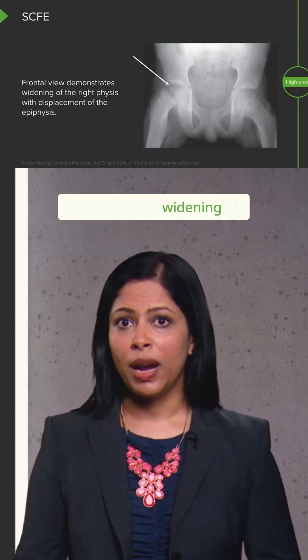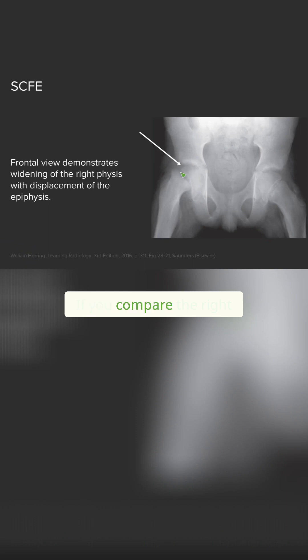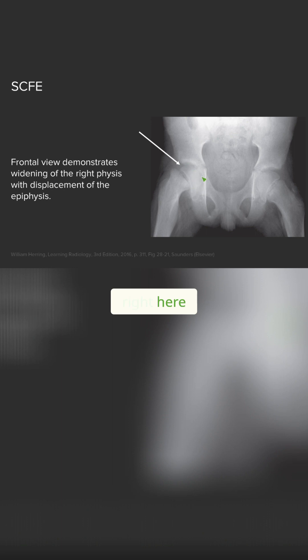The frontal view here demonstrates widening of the right physis. If you compare the right versus the left, you can see that the right is actually significantly wider than the left, and it also results in displacement of the epiphysis. This portion of the bone right here is the epiphysis, and when you compare that with the left epiphysis, you can see that it's actually been displaced medially.